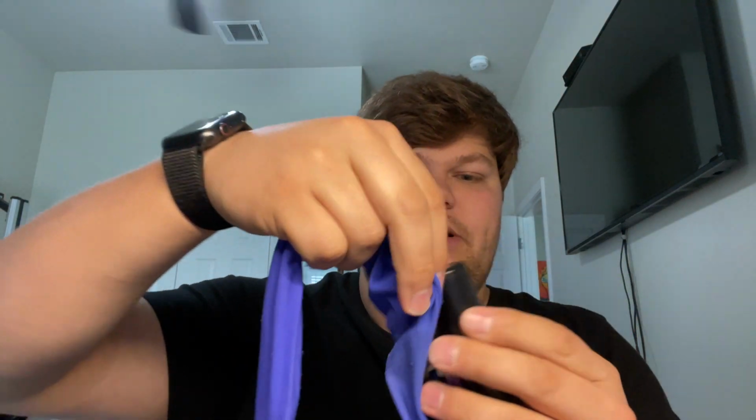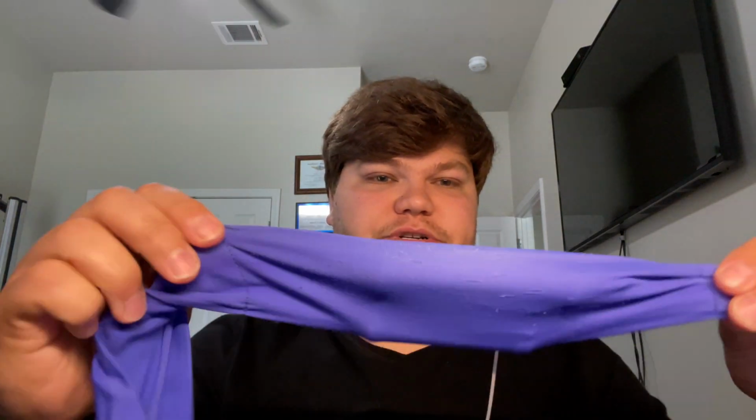You can see that there's another flap under here to where when I go to bed at night, I take my pump and it kind of rolls up in here and then fits together, and then I wear it around my waist. So the pump stays in there. I do like this. The material is kind of stretched in this one particular pocket because it's the one I always use. I can quickly open it up and see what my pump's saying, or figure out what that stupid alarm that keeps going off is for. We all have that struggle.